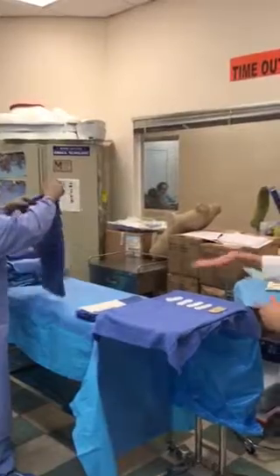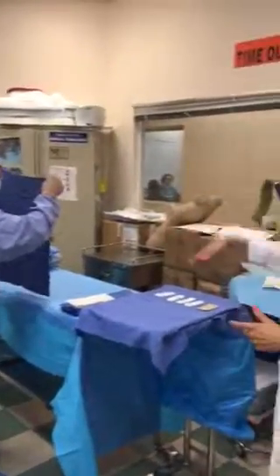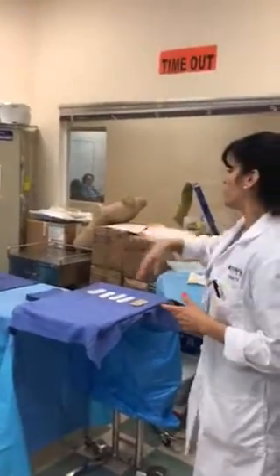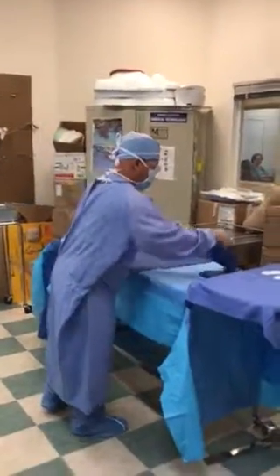Put these towels on a corner over there so that you have room to drape up here too. Put that one over there for now, and later on you'll go behind and do that.